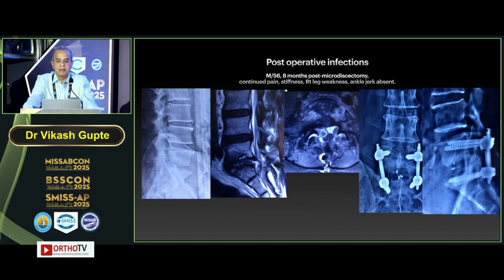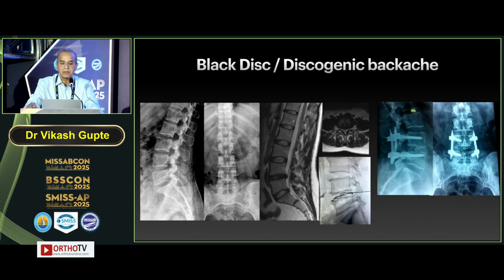Post-operative infection: this patient was operated on outside, a microdiscectomy was done, with continued pain, and he gradually developed fever. This is 8 months post-op, he presented to us, and we did MIS-TLIF.